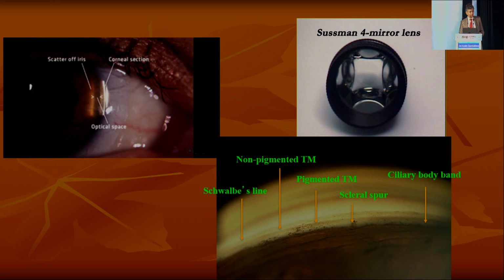So basically with angle closure, you have to keep your antennas high up and look for angle closure almost in every patient who is walking into your clinic, because it can be quite silent. And the well-described van Herick test is useful even in a very, very busy OPD. If you look at the peripheral anterior chamber depth and compare it with the corneal wedge, then you can see if it is shallower by 1/4, then you know that it is a suspect, and you can immediately catch your gonioscopy lens and do a gonioscopy.